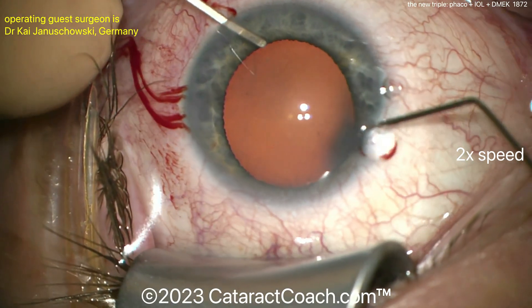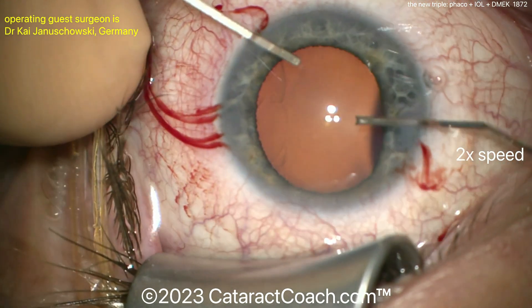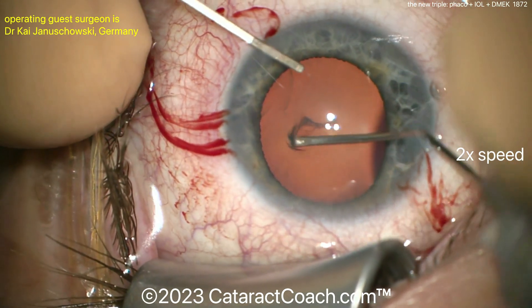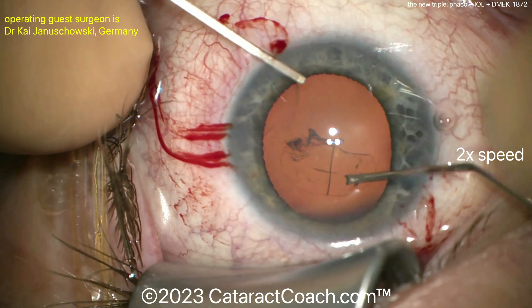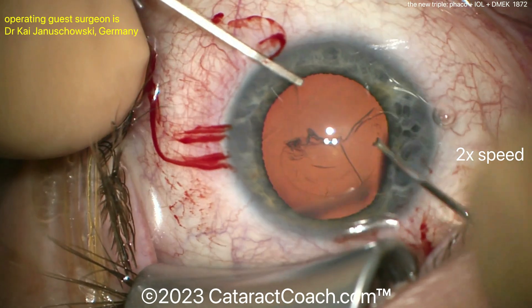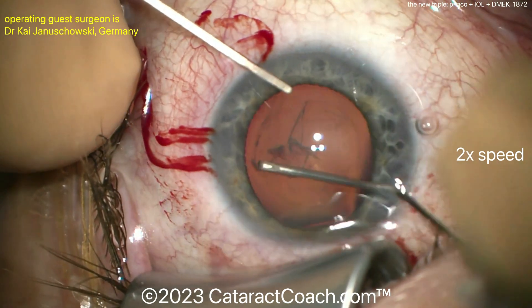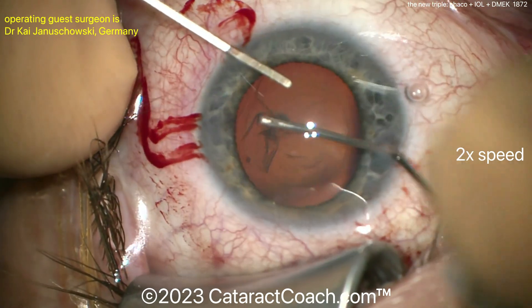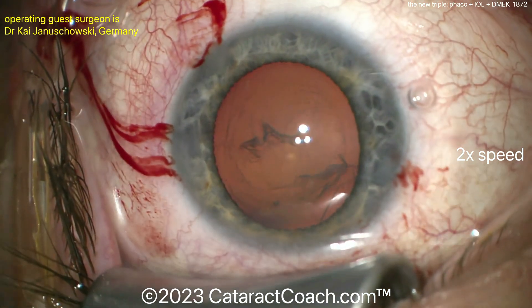In doing this, a couple of hints. Let's talk about lens calcs. When you do IOL calcs and the patient's going to have a combined FACO and DMEK, remember you're going to get a hyperopic shift from the DMEK tissue, usually about a half diopter or so. So a smart move, if you want the patient to have an emmetropic or plano outcome, is to aim your IOL calcs for a post-op goal of close to minus 0.5.